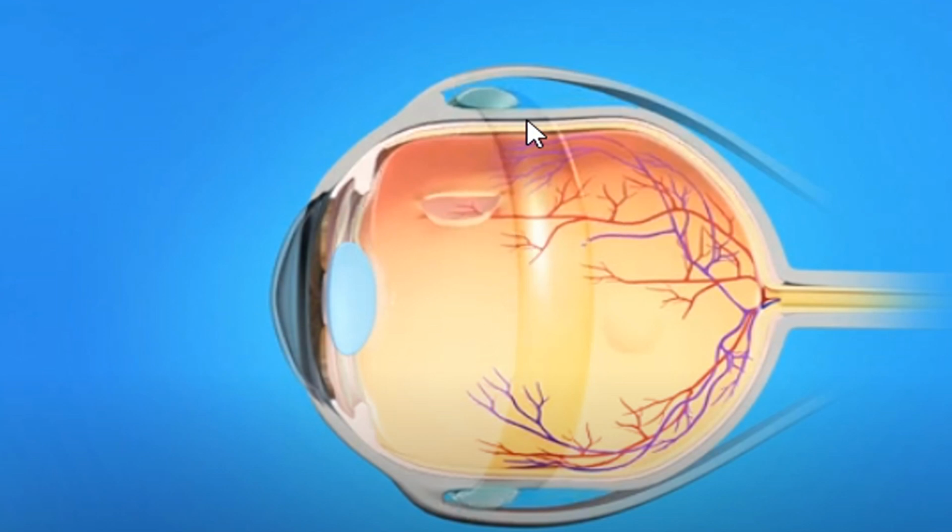So what happened? You brought this area narrower, but you extended this area just a little bit. This little bit actually is making 1 or 2 diopters. So you are having a myopic shift in your patient, and you are also increasing the intraocular pressure and all the complications that I told you about in the scleral buckle.